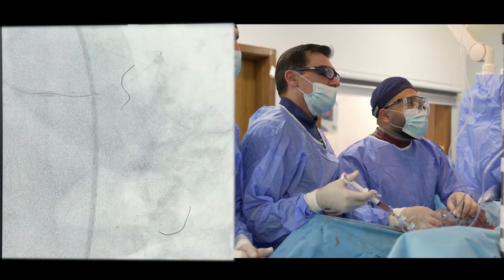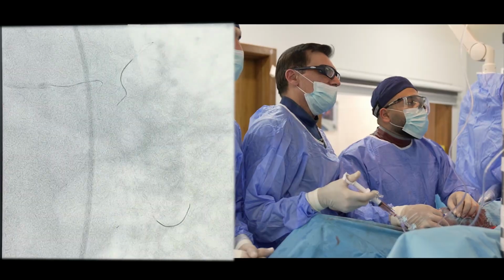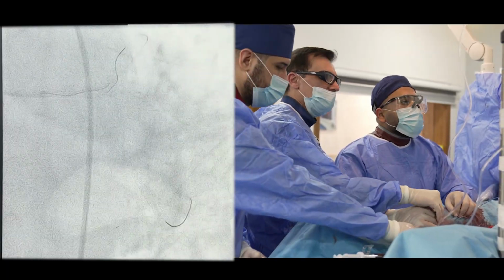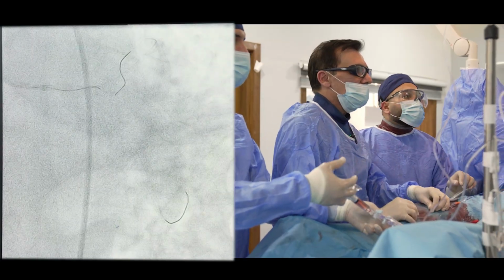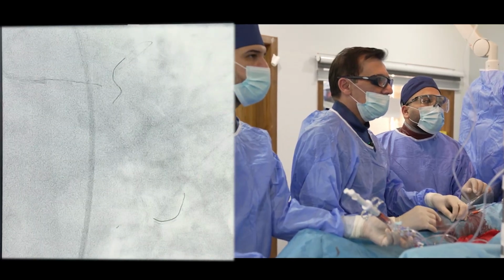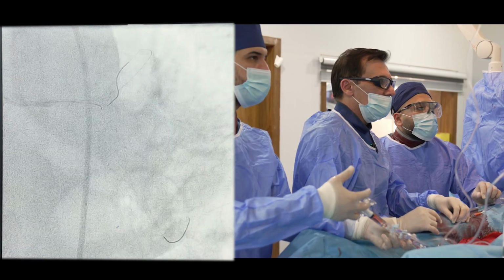No. You have to free the wire. The wire should be free. It doesn't look free to me. Let me see. Wait, give it. We need secondary. Okay. Test.